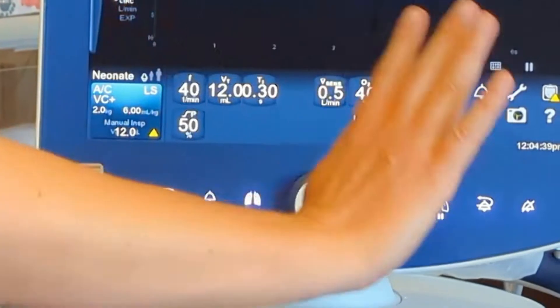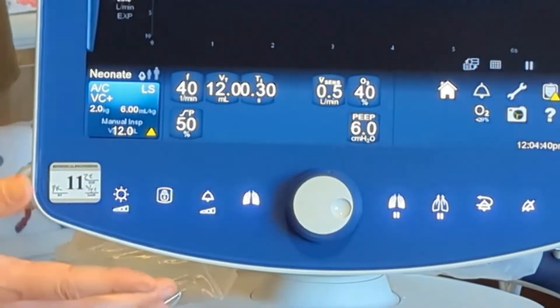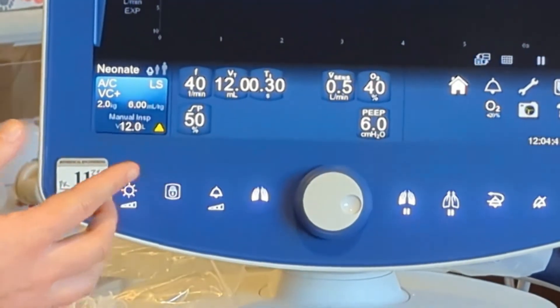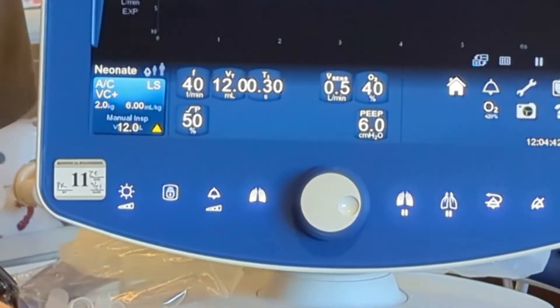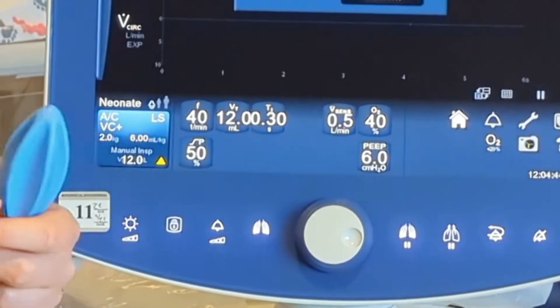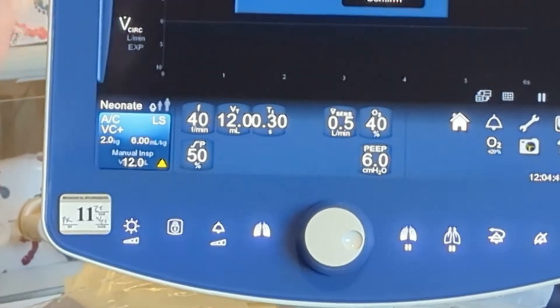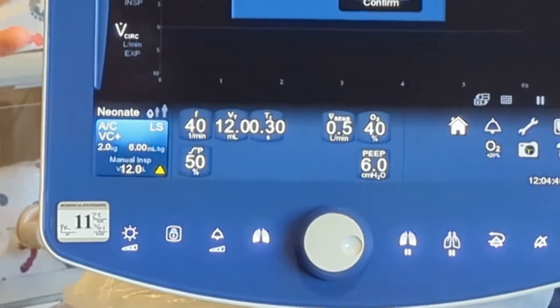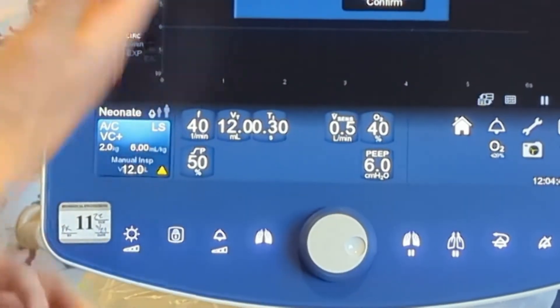We'll just go through the basic settings down here. Danielle and Reese can help with the normal values that we like to set.